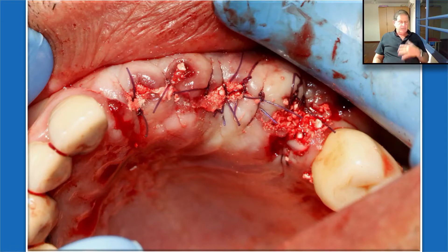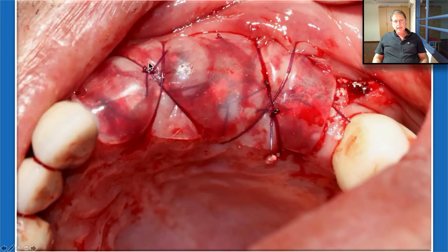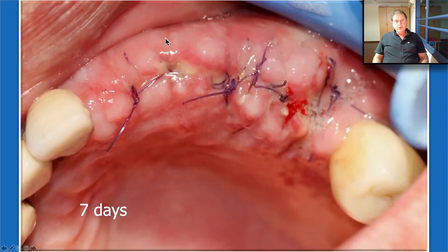In sockets we sometimes leave it 10–14 mm exposed — we stretch the soft tissue, suture it nicely, and protect it with the Oraid. It's very easy and nice to work with because it sticks immediately to the soft tissue. We need to secure it by suture as always — we go from one side to the other, and two cross sutures are sufficient for such a large area. We know the Oraid band will never fall. That's how it looks already seven days post-op.